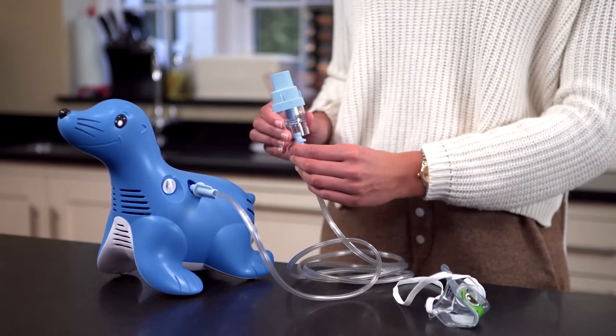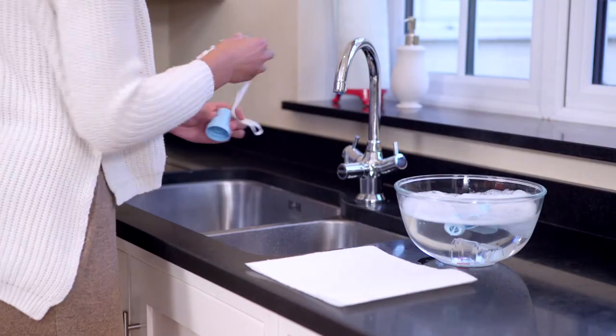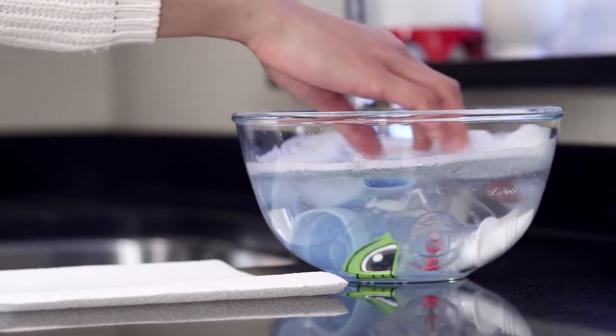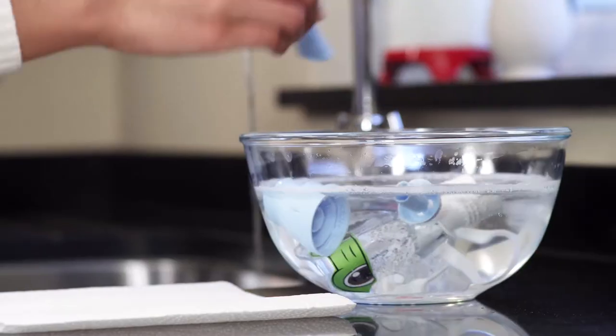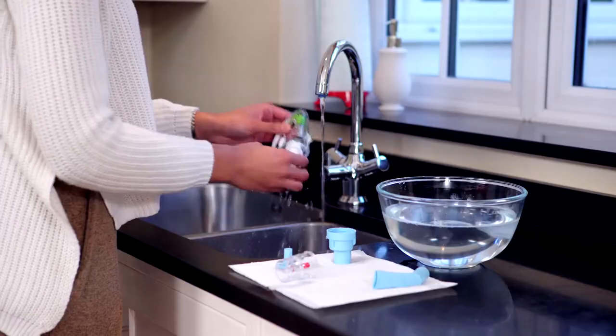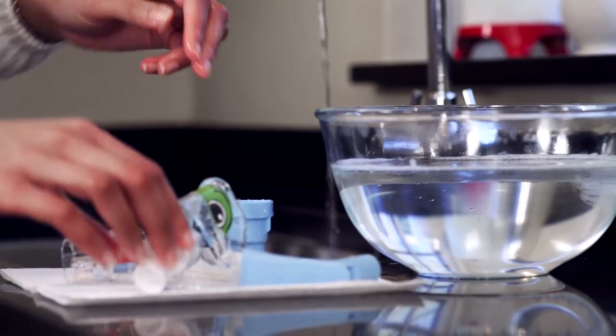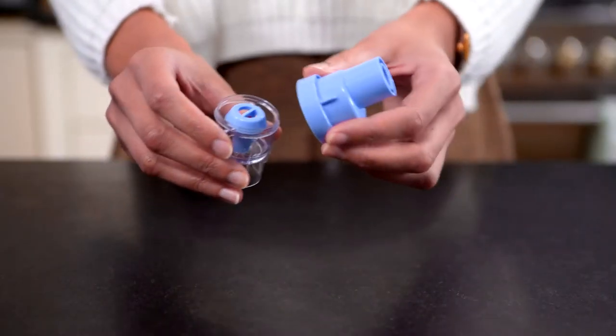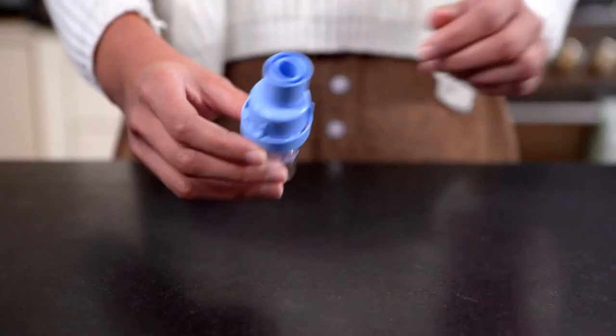Disconnect tubing from the medicine cup. Wash all items, except tubing, in hot soapy water. Rinse all parts in clean water for 2 minutes. Shake off excess water and allow to air dry. Do not towel dry. Reassemble and store the Sidestream in a clean place when not in use.